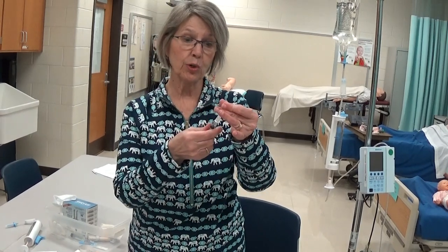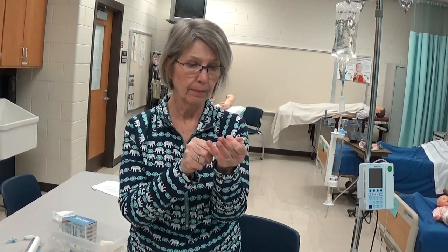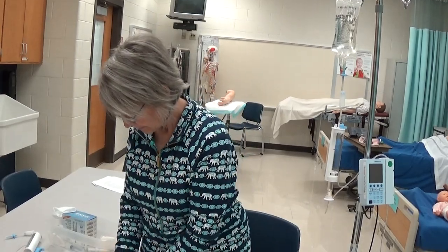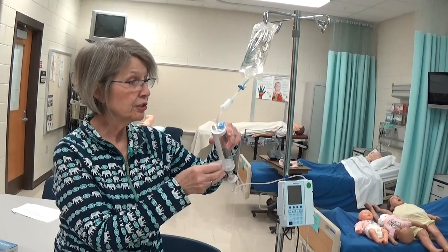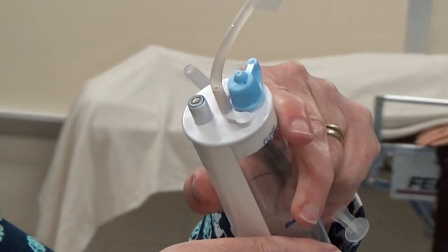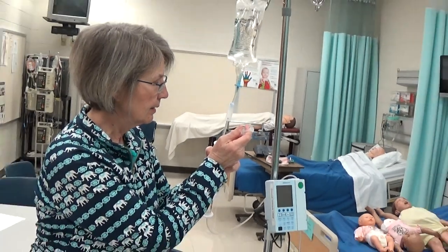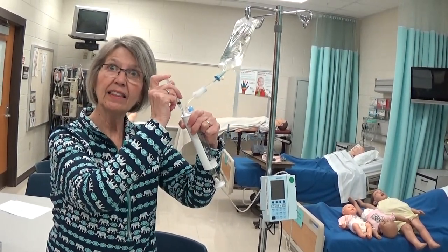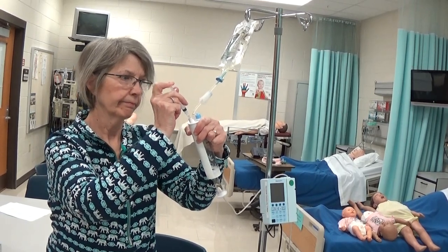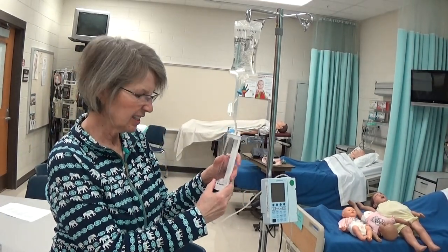On the tip of this syringe, make sure that you put a blunt tip needle. Then come to your soluset and cleanse the injection port — it's got a blue ring on the top. And then you're going to squirt your medicine in just like that. Mix it up a little bit, and that's all.